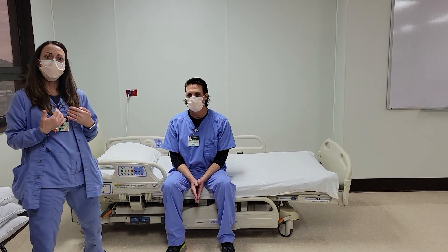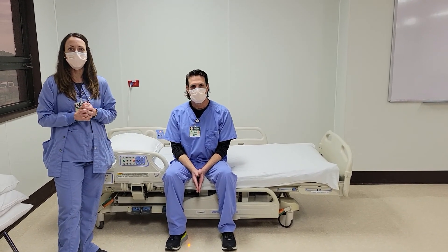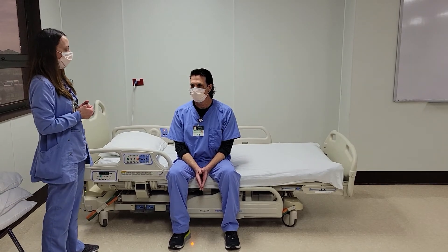I'm Miranda with Physical Therapy and this is Steve, who's also with Physical Therapy. We're here to talk a little bit about bed controls and positioning your patient in bed.